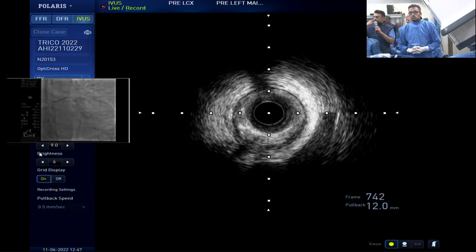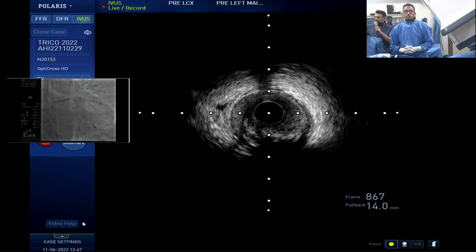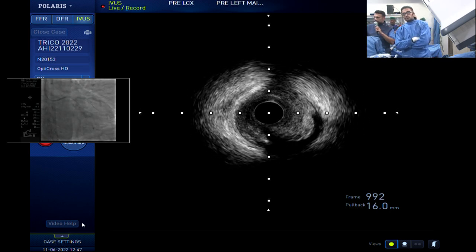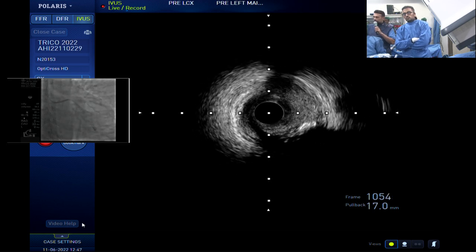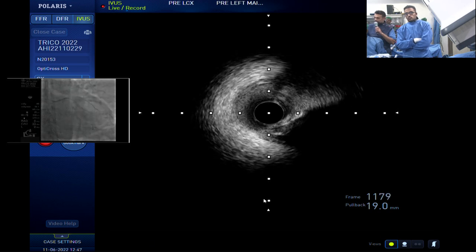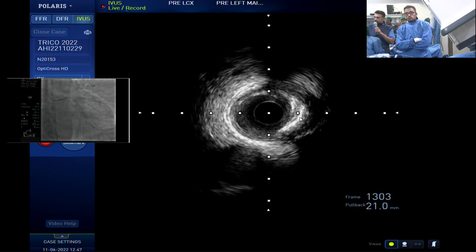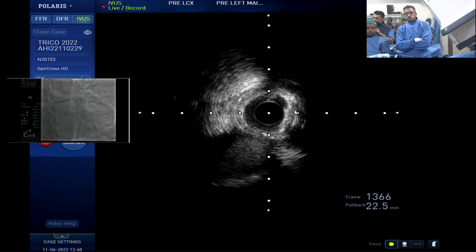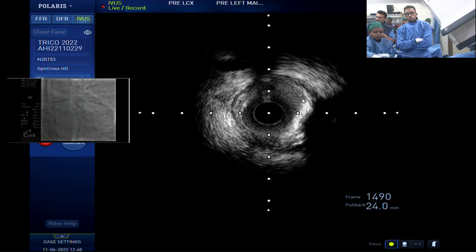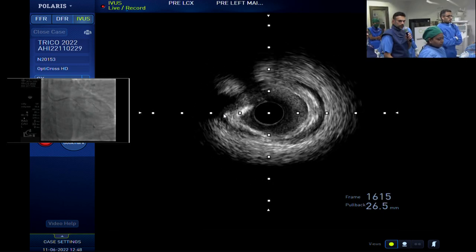So here's your plaque where you've pre-dilated. Now, it's important to look at the composition of the plaque, right? So the plaque here is largely fibrotic plaque, yes. Right? There's no real calcification there. I'm not worried about stenting this, but what people will be so focused on is where to put the stent, they'll forget to prepare the plaque. There's some calcification there, right? But it's only in one quadrant. It's not going to limit stent expansion because you have the entire rest of the vessel available to you. There's the ongoing circ that's coming in. So again, just one and a half quadrants, not something I'd be overly worried about.